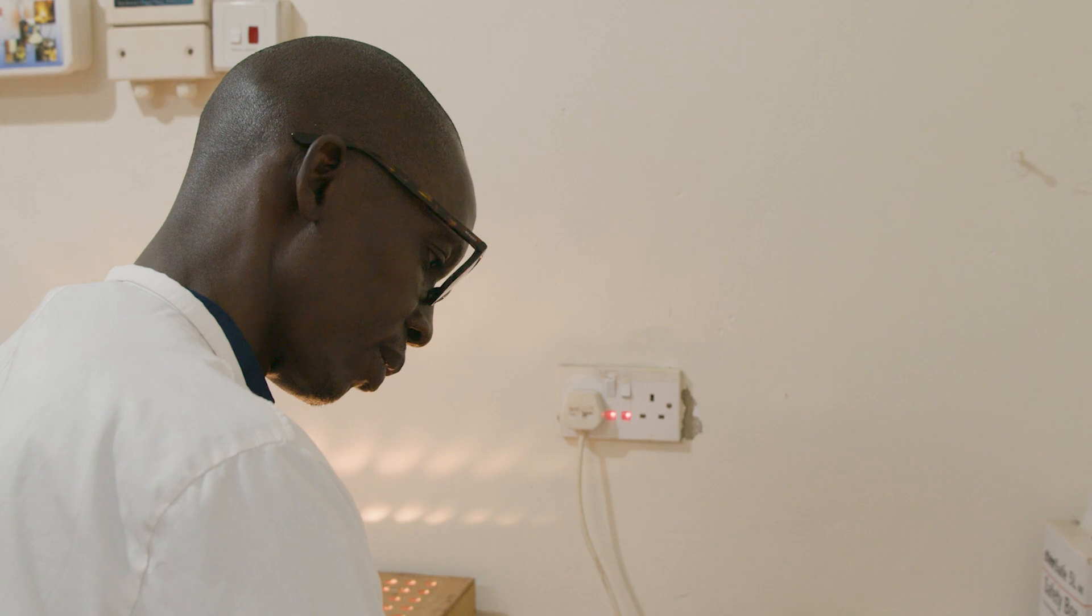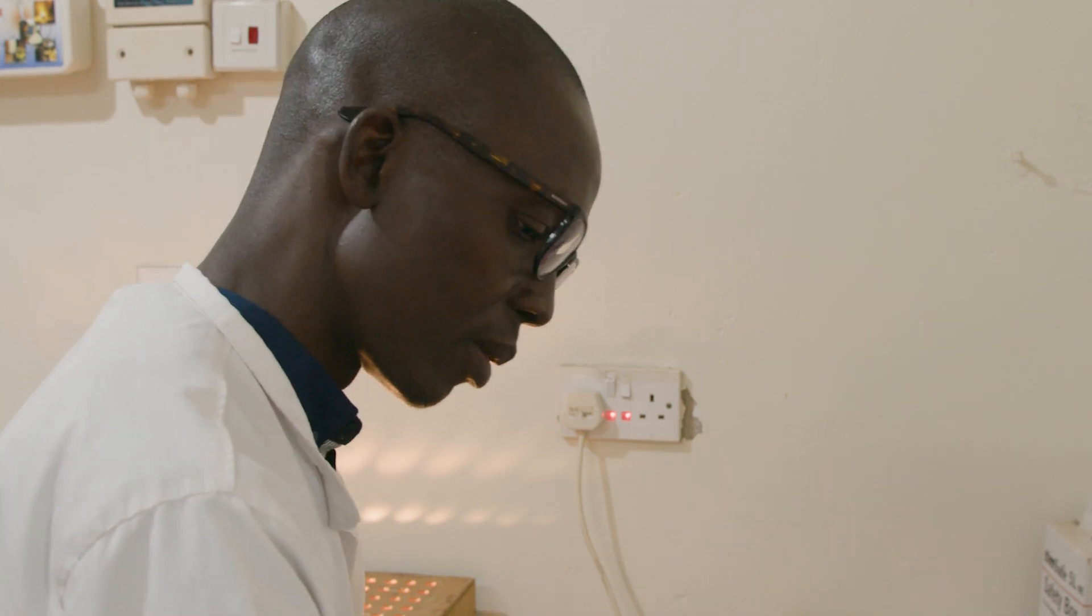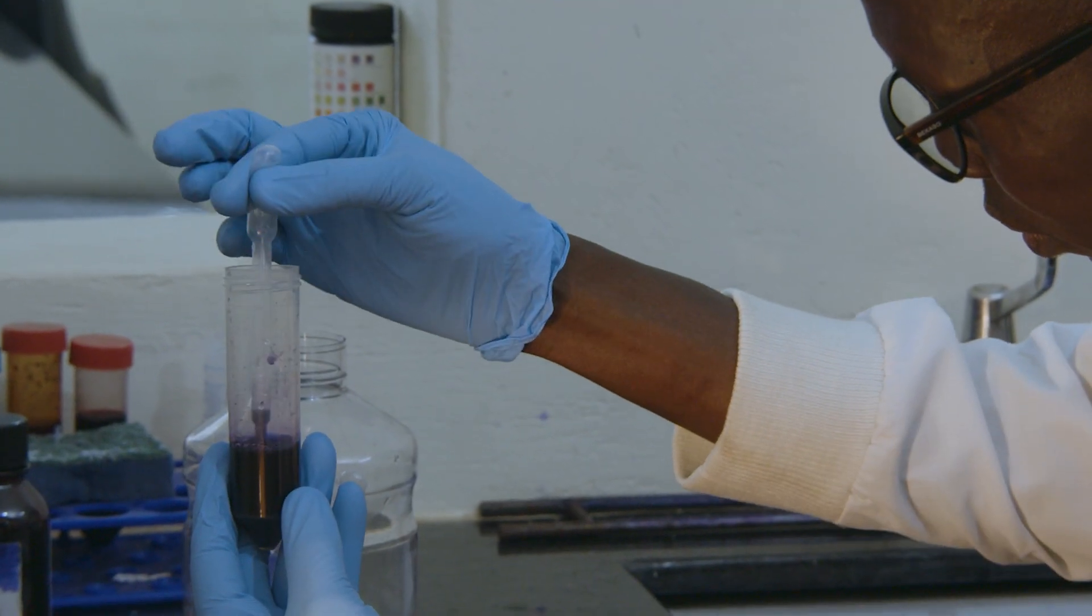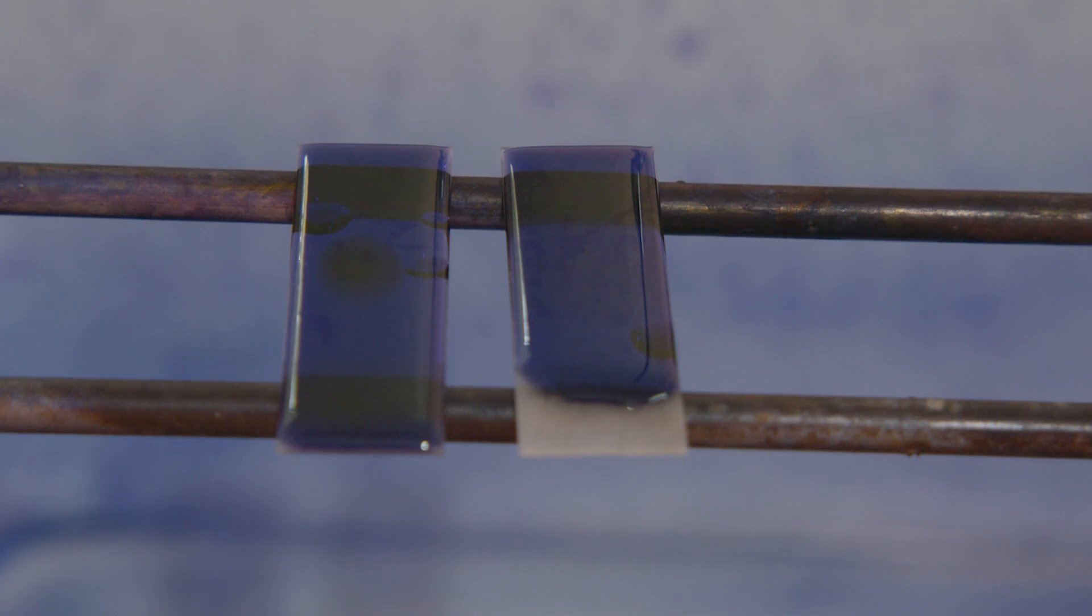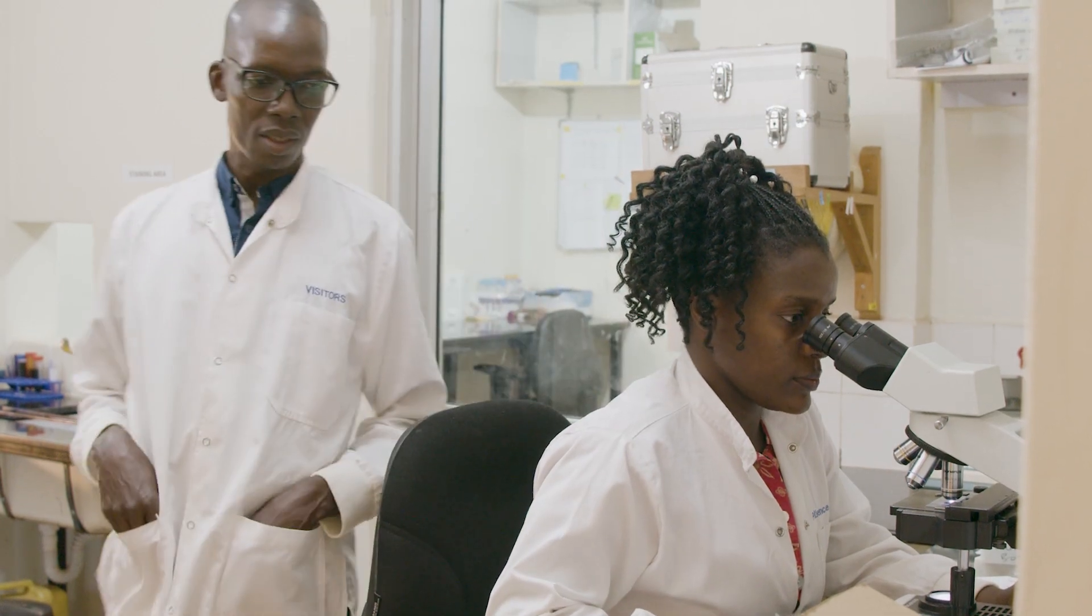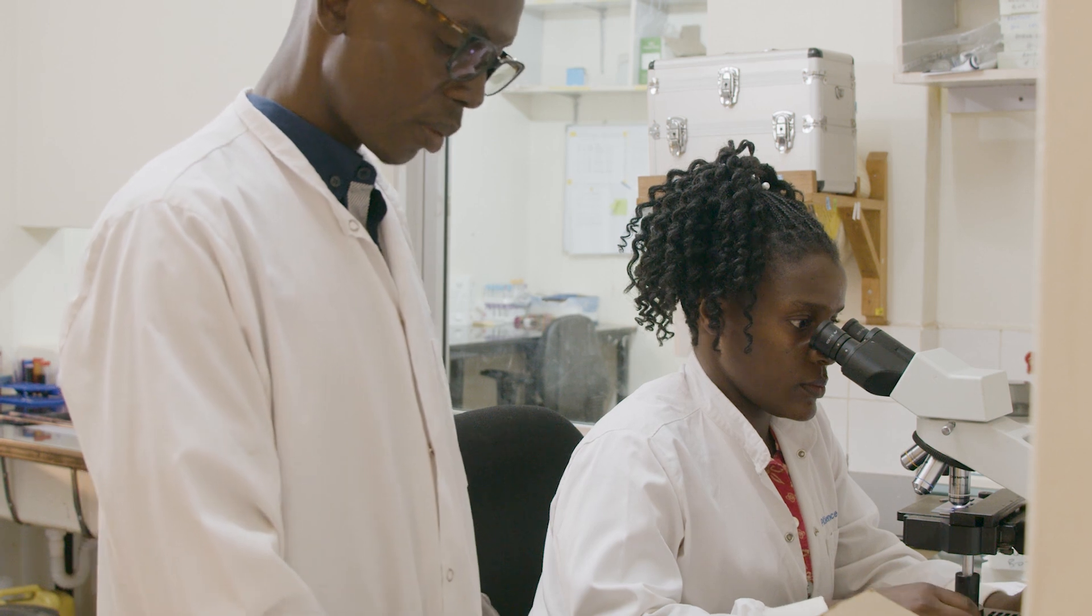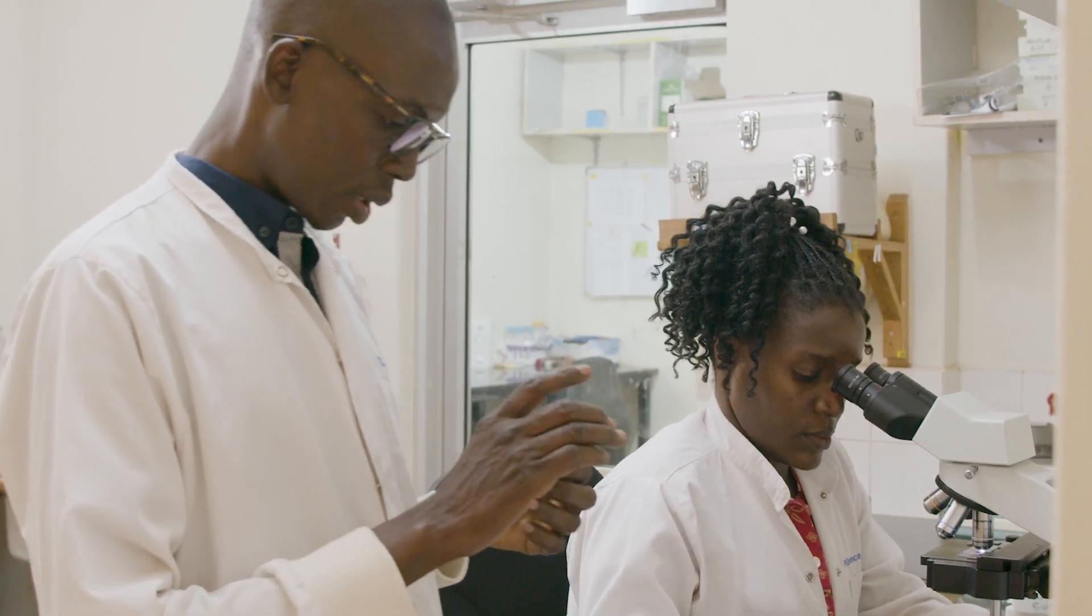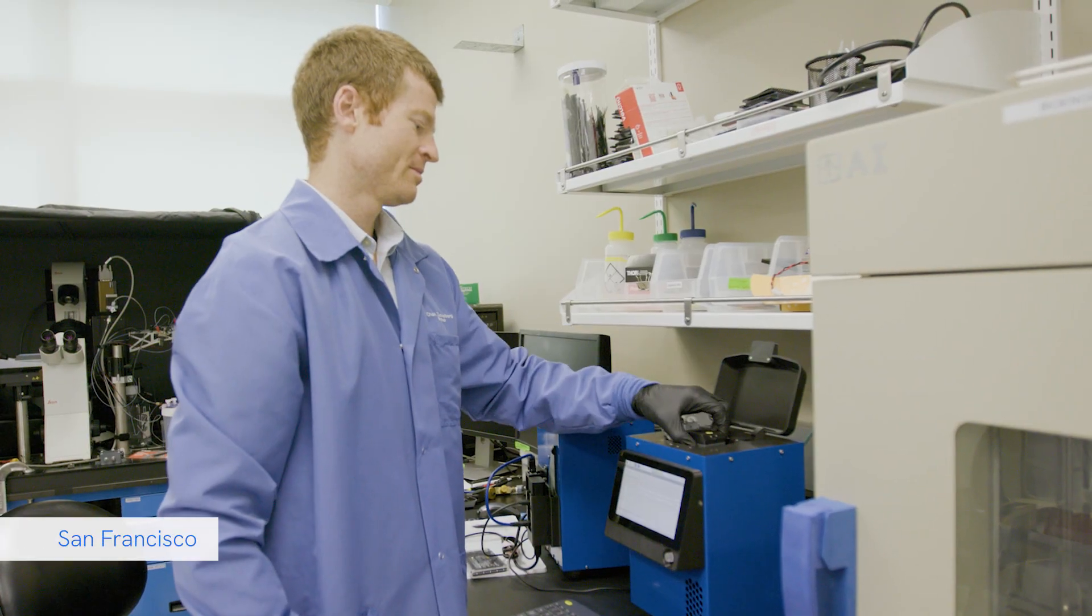This microscope has quite a lot of advantages. We will be able to avoid things like stains, which are very expensive. We will also be able to save time. The conventional method, the minimum time you can give someone the result is one hour. That's still too much compared to the time this machine gives us results. Because if someone is highly parasitemic, in one or two minutes, you already have the result.